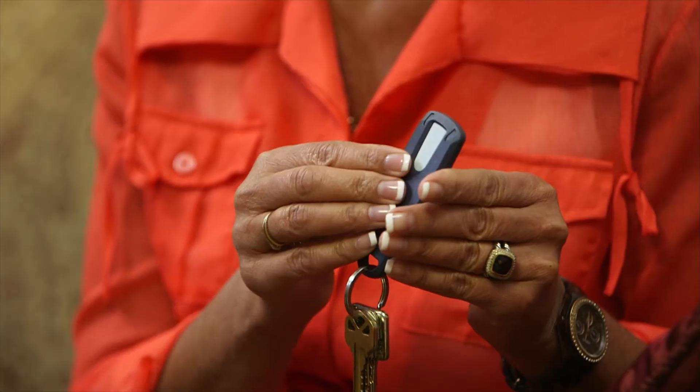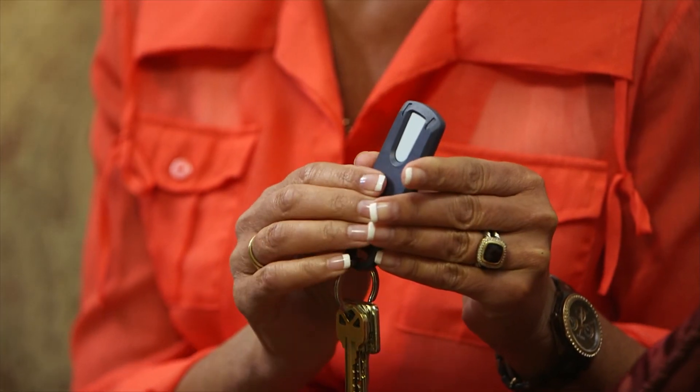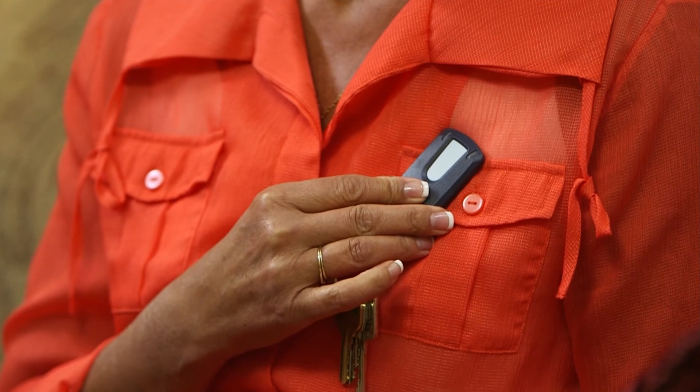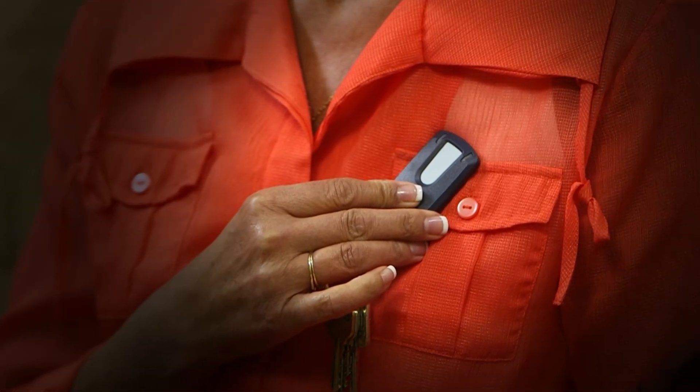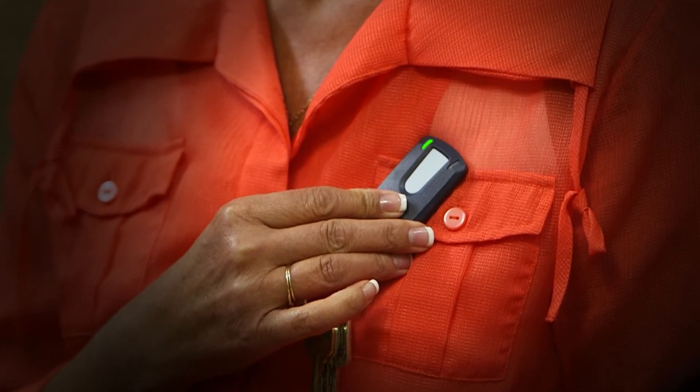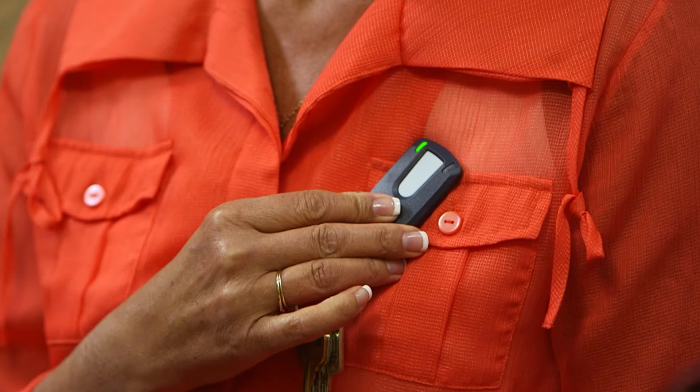When you feel a symptom, you'll have about five minutes to mark it with the patient assistant. Otherwise, just write down the day and time of your episode to share with your doctor later. Using the patient assistant is simple. When you experience a symptom, press and release the button. The searching light will start to flash blue. Next, hold the patient assistant flat against your chest directly over your RevealLink ICM. When a symptom is successfully marked, a tone will sound and the success light will illuminate green.